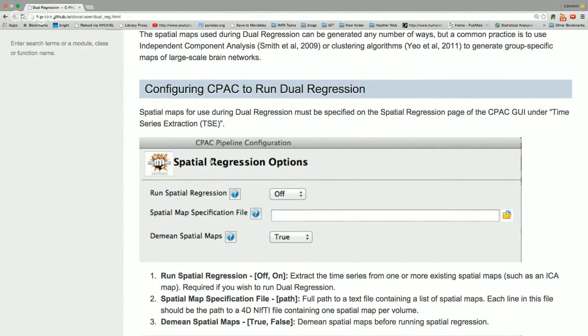If you wanted, but what dual regression allows us to do is to take a map of the default network, such that it's extracted by ICA or from a different analysis, and extract the network corresponding to that map. So what you might think of doing is just binarizing the default network you get and then calculating the average across all of those and then using that to create your default network map, right? That may be one way of doing it.